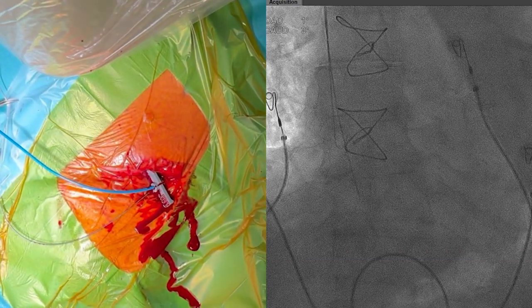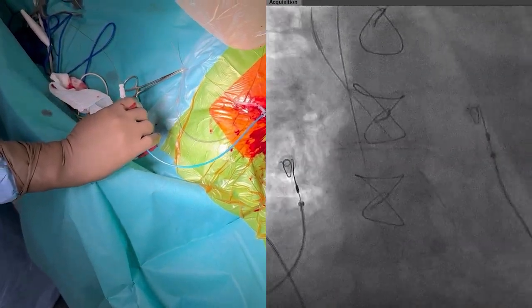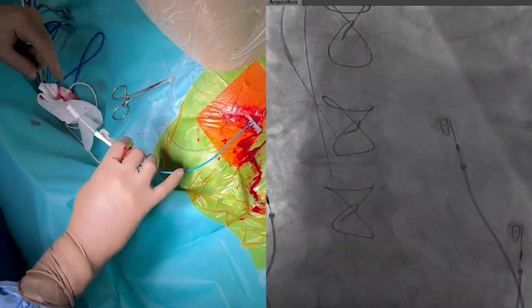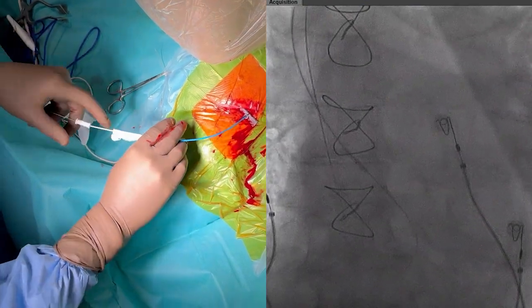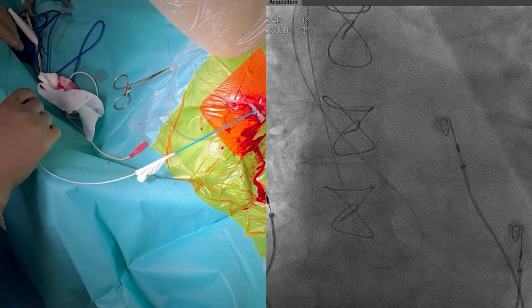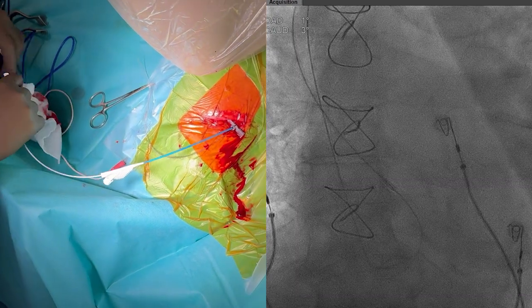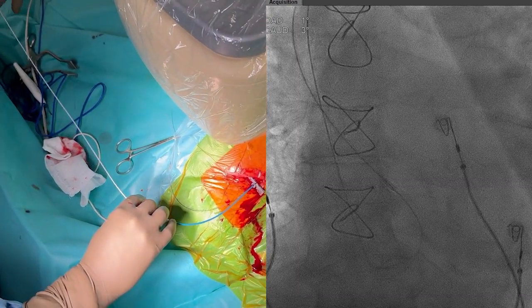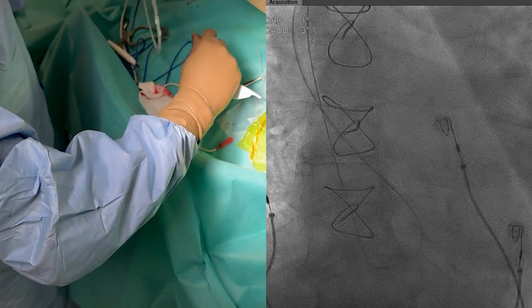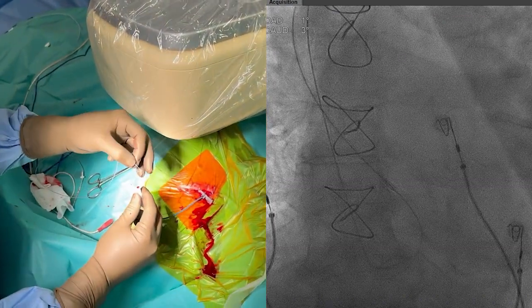We have used an axillary venous approach, of which we have another video. The guiding catheter can be introduced into the heart together with the dilator and the guide wire. In some cases the guide wire can be kept in place to gain access to the RV when it was difficult to pass the tricuspid valve, but in most cases this is not necessary.